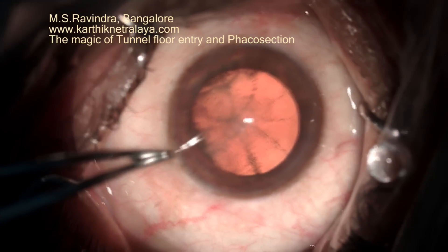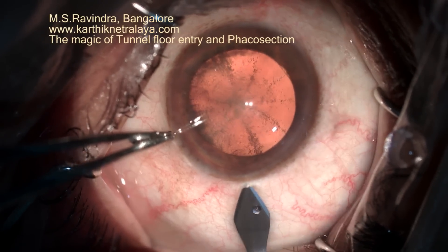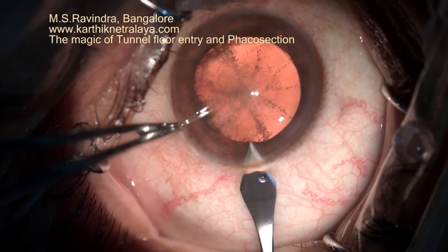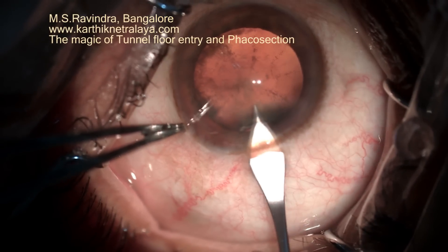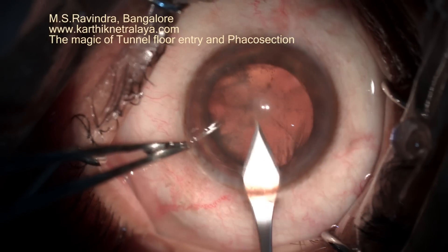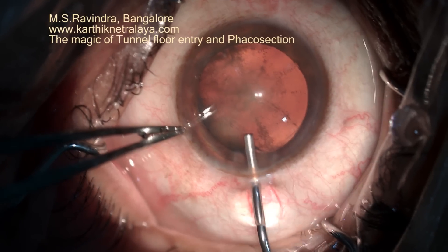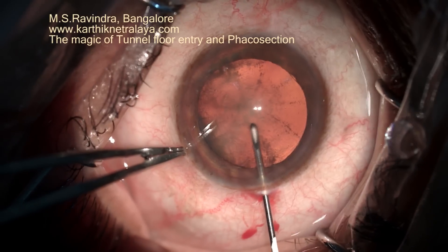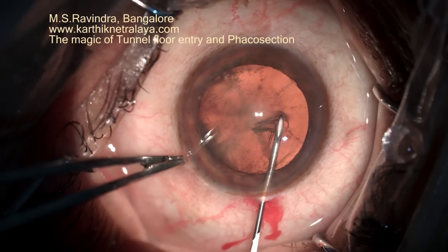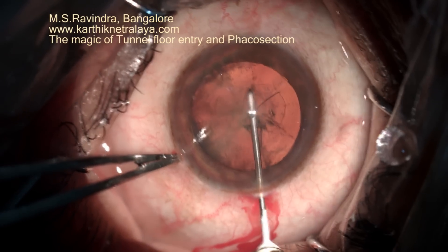In this novel technique of cataract surgery, a direct entry to the anterior chamber is made through the conjunctiva, a small portion of sclera, limbus and cornea. The anterior chamber is filled with viscoelastic, and the cystitome enters the anterior chamber through the floor of the tunnel, rather than going through the entire length of the tunnel that has been created.